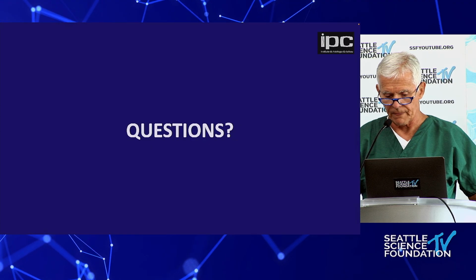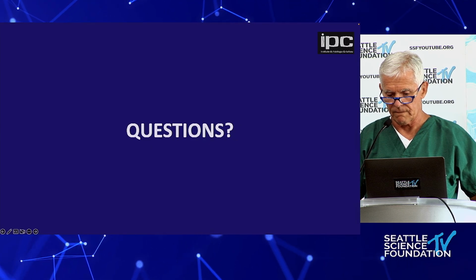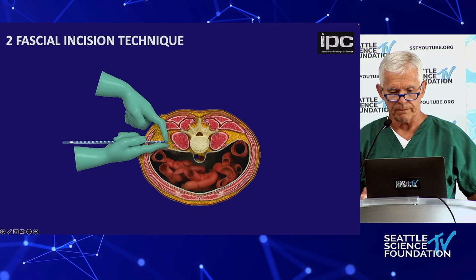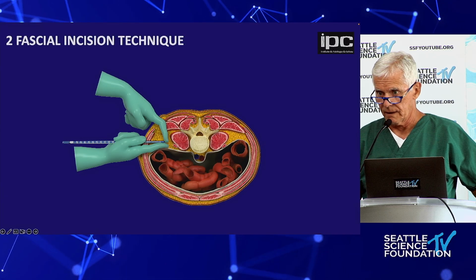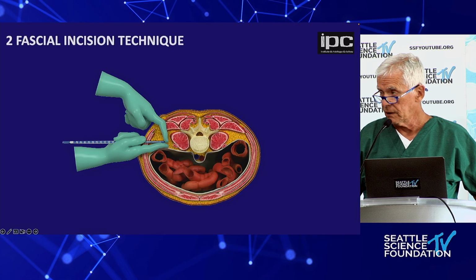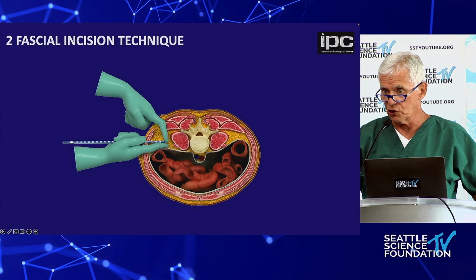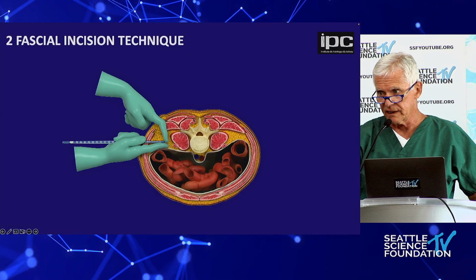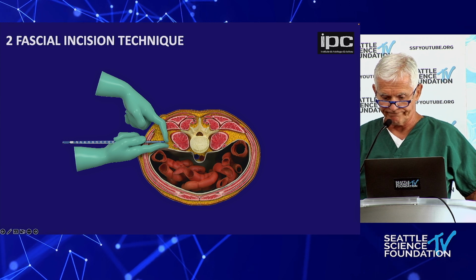And I think we saw Neil doing it with OLIFs, but it's a smaller incision. Yeah, that's perfect. I actually love that. So that's the best way to be safe. So you go close to the quadratus, even if it's a Japanese patient that is super slim, there is a small triangle of fat in front of the quadratus.